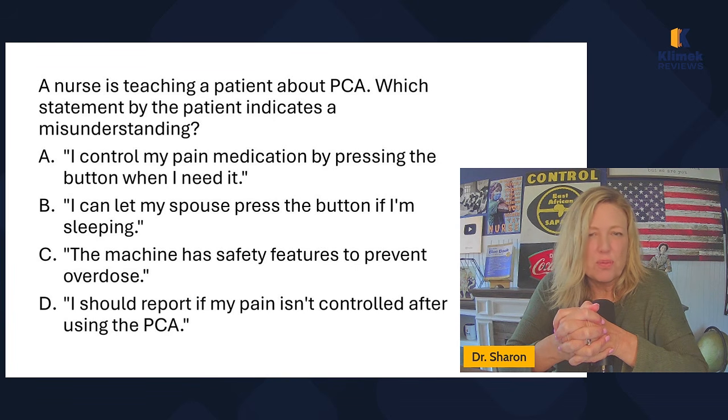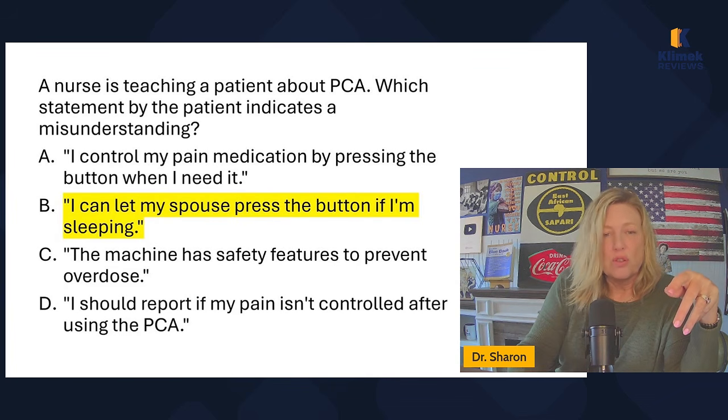The machine has safety features to prevent overdose. That's not a misunderstanding. That's a true statement. I should report if my pain isn't controlled after using the PCA. Well, that's a true statement. You should do that. So we cannot let the spouse press the button.